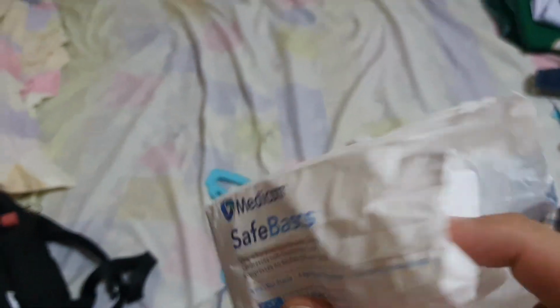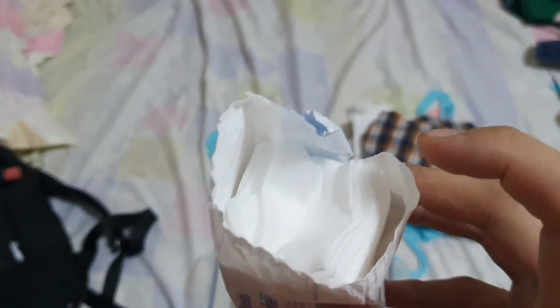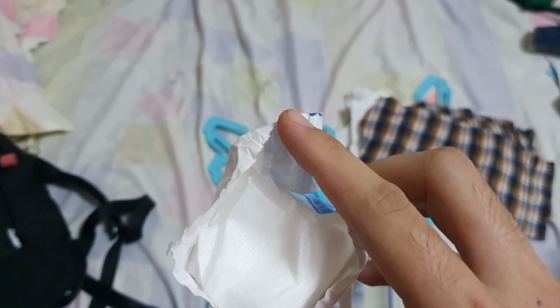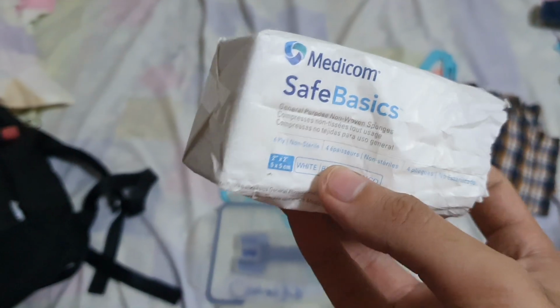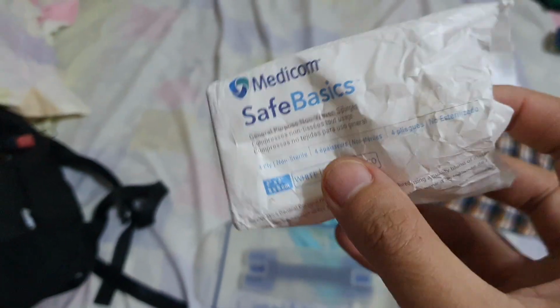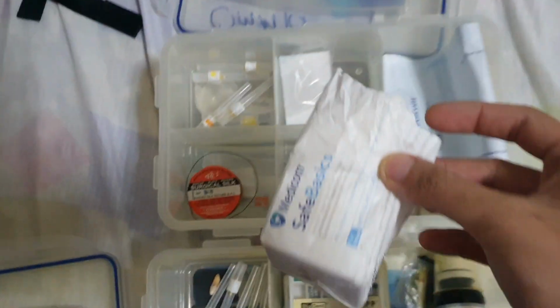And of course, this is the gauze that we use. The gauze is very, very important because it's to control the bleeding of the patient, and also if we're going to do elevating the tooth, the gauze is very important also.